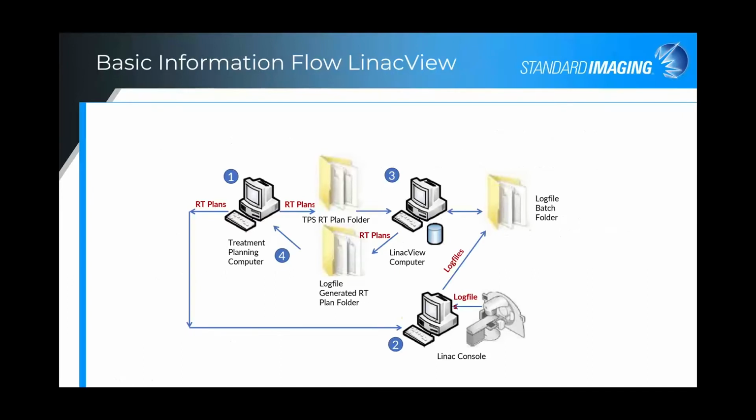So here's the basic information flow for Linac View. Everything, of course, begins with the RT plan, exported over to the Linac View computer, as well as through to the Linac console. Then as each plan is delivered, you could deliver before patient treatment as pretreatment QA, or just begin with your first treatment fraction, and the log files would be picked up and analyzed.